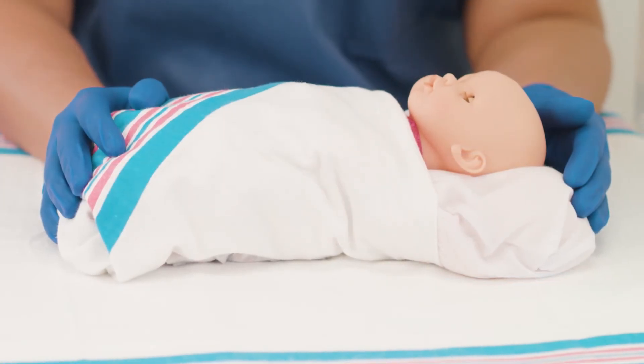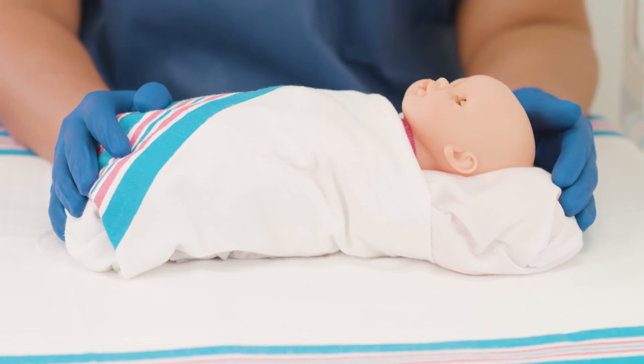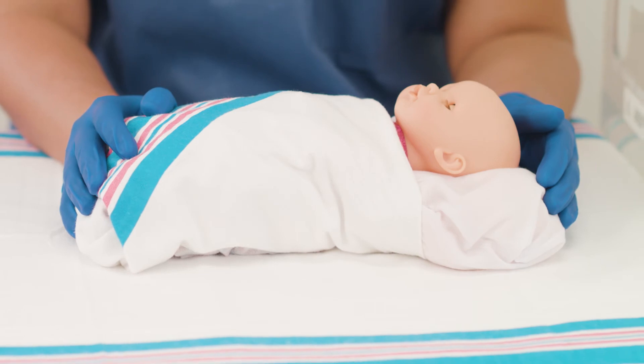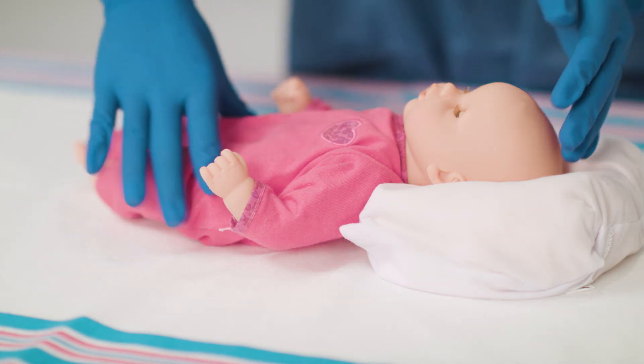Whether used for supine or side-lying positions, the Molnica Fluidized Positioner offers significant advantages for both the infant and the attending staff. Neonatal positioners can be remolded to allow for routine or medically necessary position changes. When the patient's medical condition allows for it, begin by removing the infant from the positioner.